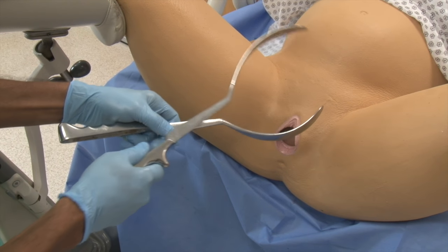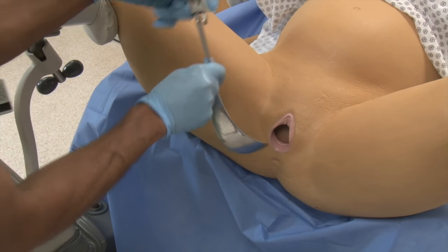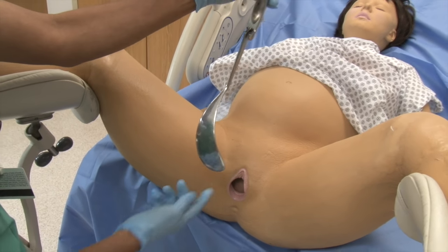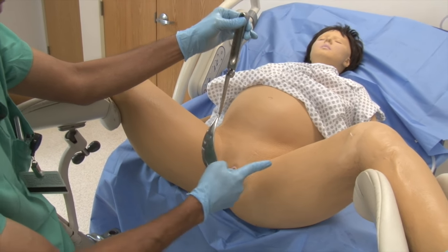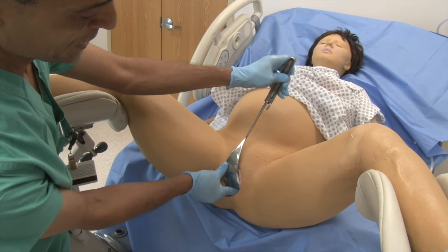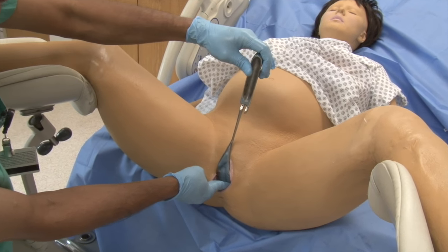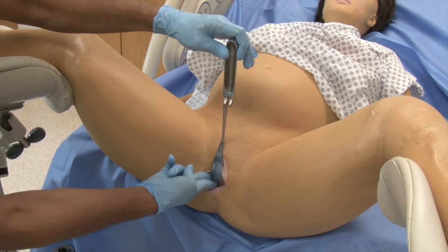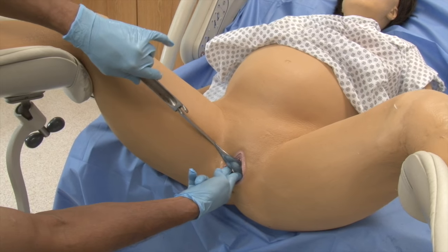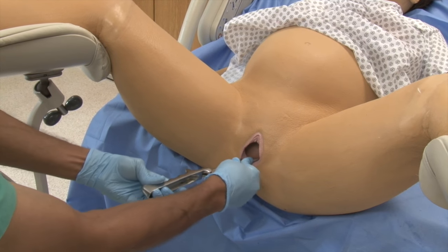I'll take one blade off and put the patient's left side blade in first. This is the first application on the baby's head. I'm holding the blade with my left hand to go on the patient's left side, and it's going to go first on the perineum — I'll protect the perineum with my fingers. The blade goes into the patient. My fingers will be holding that blade on the baby, and I'm rotating my left hand against mom's thigh for a very light, easy application of that forceps onto the fetal head. That's the first blade.